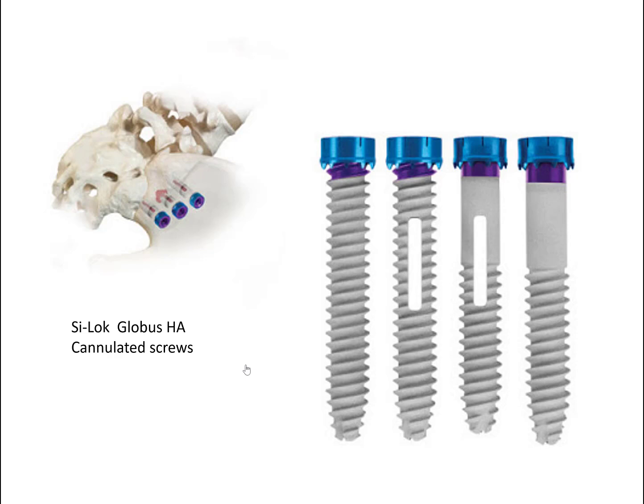So let me just go over a couple more things. This is the Globus product, which is hydroxyapatite coated with a hole. So basically you fuse this, but my thought is this thing will eventually break if there's motion. I don't know, maybe not. Bobby says he didn't see many broken screws. I don't think they break much because I don't think there's that much motion across the joint.